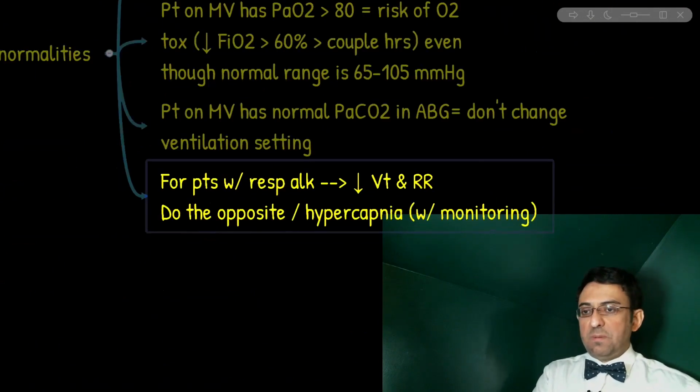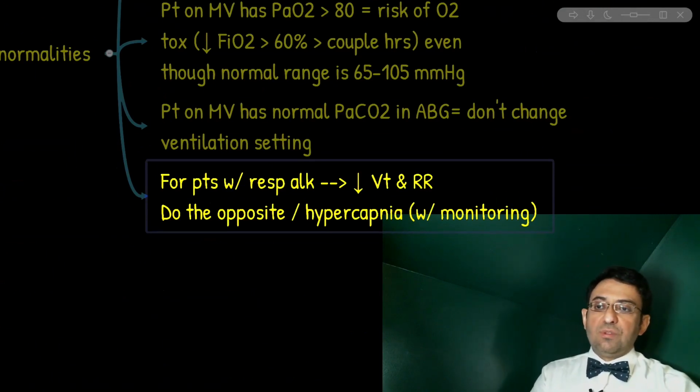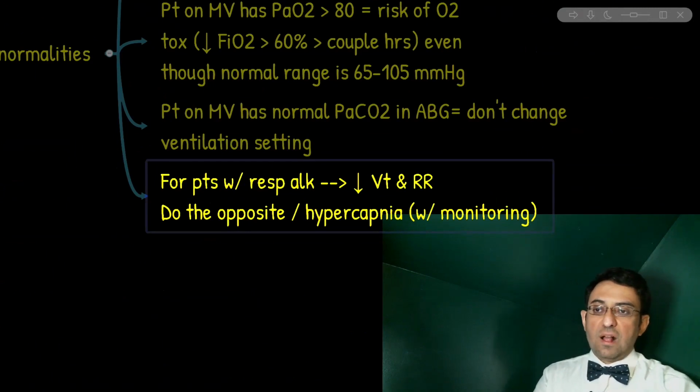Except for the ICP patients, say the patient connected to the mechanical ventilator is reported to have PaCO2 less than 36. What is your next intervention? We need to reduce tidal volume first, but if tidal volume is okay, we need to reduce respiratory rate, whatever shows to be higher than our standard setting. You remember, the initial or recommended setting for tidal volume is usually 6 to 8 milliliter per kg, and for respiratory rate is around 10 to 12 per minute.